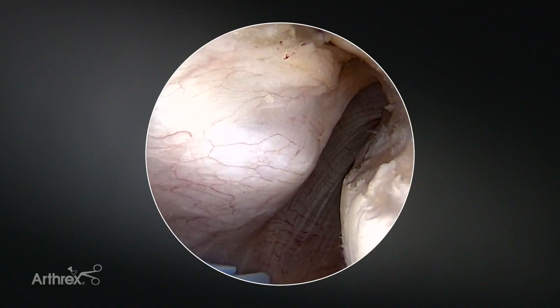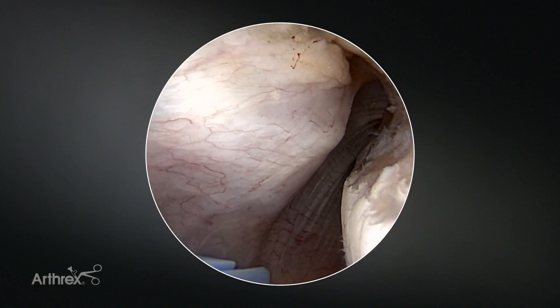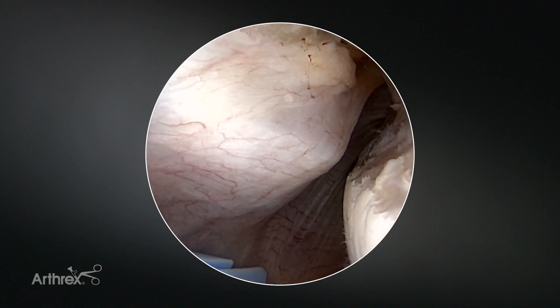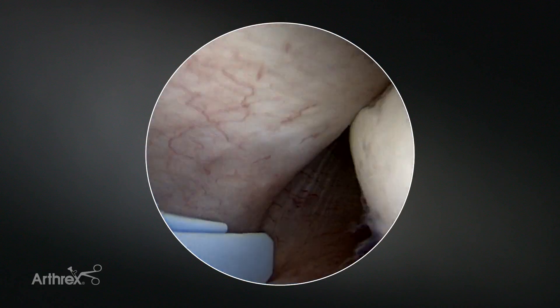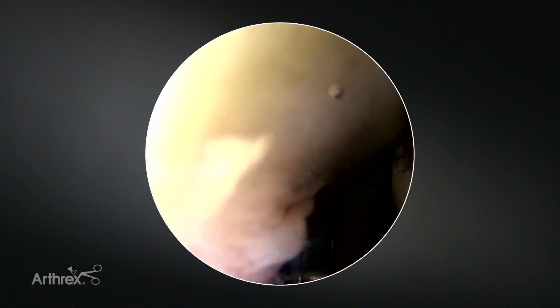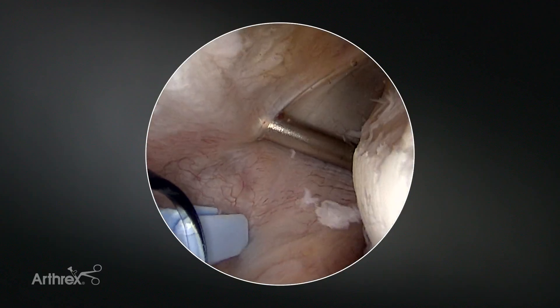I'll typically try to be right in line with the Hill-Sachs defect. I can just see the tip of the insertion guide here. That's going to provide a good angle approach because I don't want to over or under tension the posterior capsule. Once I establish that location, sometimes I will move inferior so that I'm directed where I have the most space just below the head.